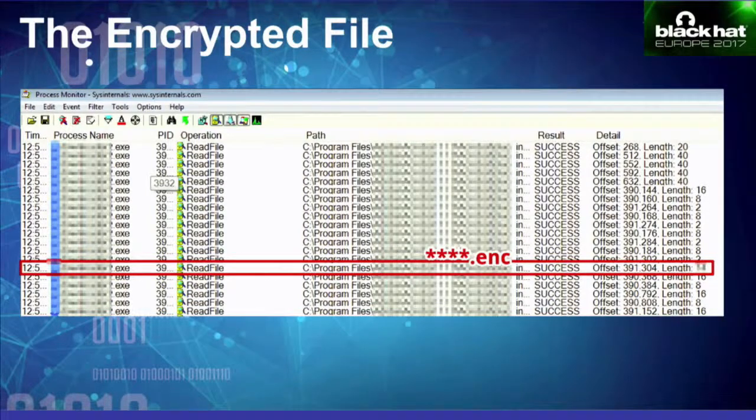After a few hours, we realized that the digital pen application often queries a file with the file extension .enc and reads that file. It queries the file, reads some parameters from it, and then somehow uses them. So we located the file on the operating system and tried to open it in Notepad, and it didn't make any sense because the whole file was encrypted.